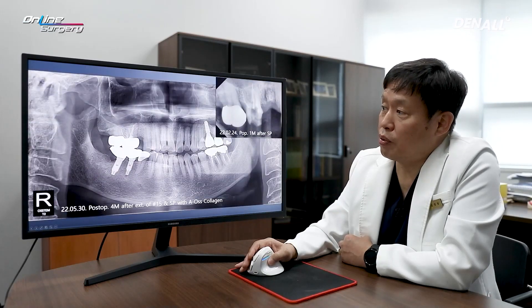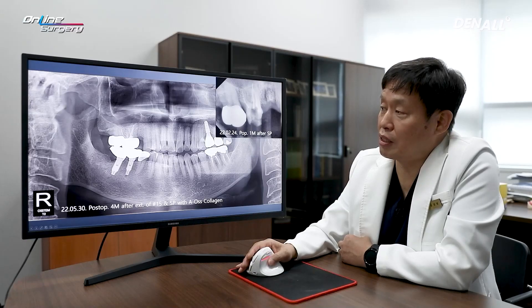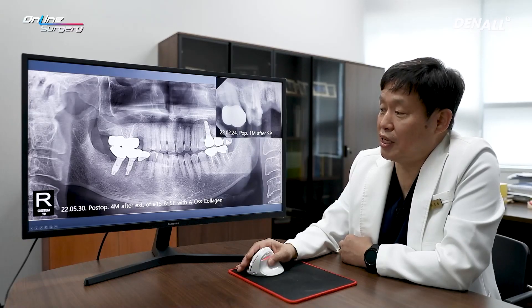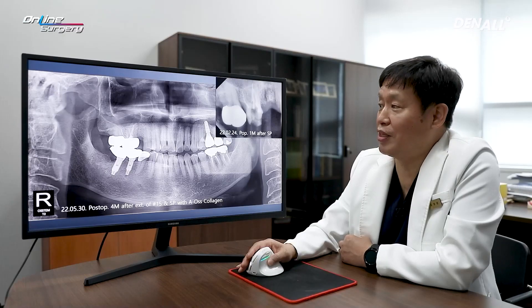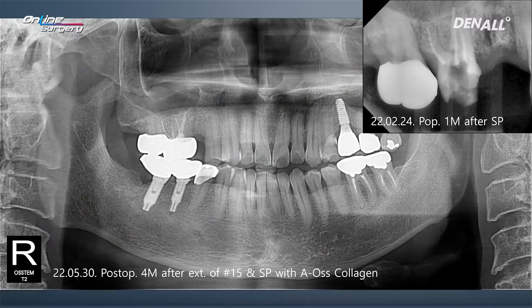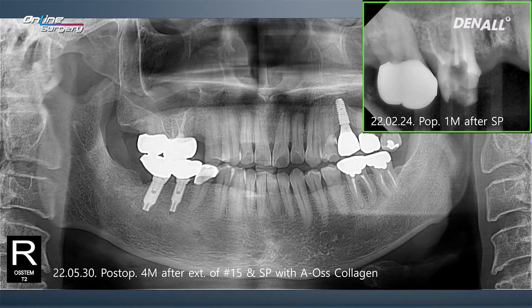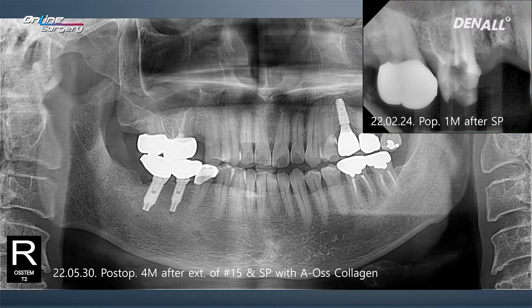I did not do the endodontic treatment myself — my colleague did — therefore the x-ray follow-up is not well reflected here. This is an intraoral image after 1 month since socket preservation. This is 4 months after socket preservation. In number 16, endodontic treatment was done and a crown was delivered.